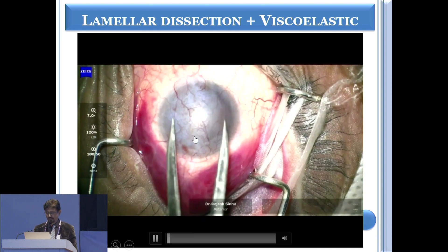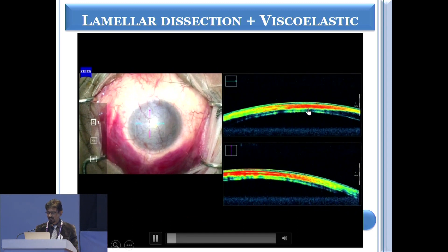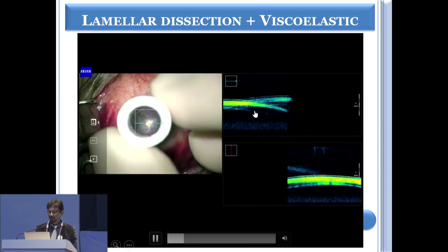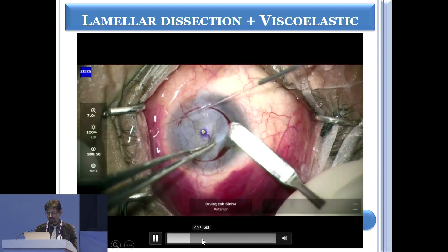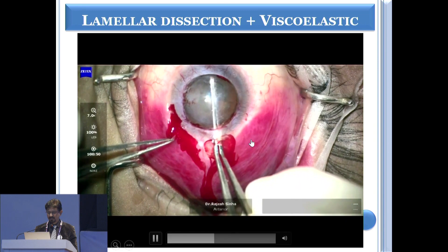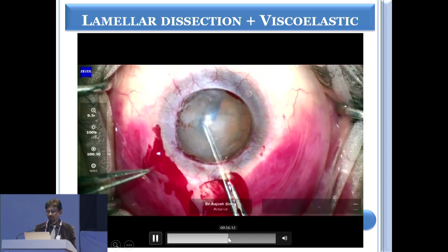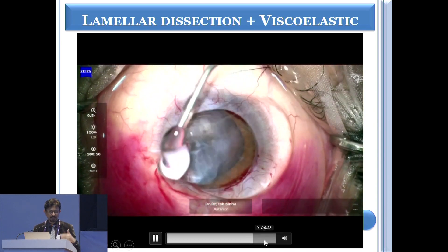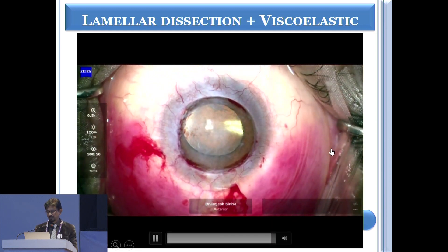Another scenario involves a vascularized opacity extending quite significantly — intraoperatively about 80% of the cornea has opacity. In such a case, you can do a lamellar graft, leave a little bit of stroma, and after dissection of the superficial hazy cornea, go ahead and complete the cataract surgery. Once you have dissected it, you can put viscoelastic on the surface, which improves visualization. Particularly in a one-eyed individual, doing an anterior lamellar keratoplasty is better than a full-thickness graft.